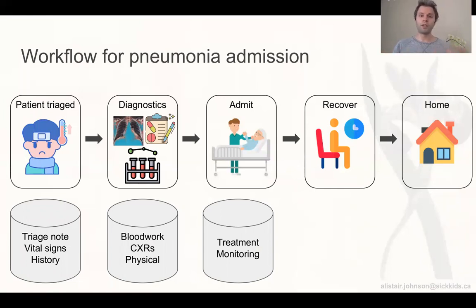And we'll hear more about combining multimodal clinical information with the chest x-ray later. And doing something like this is very important, for example, with a diagnosis like pneumonia, because pneumonia is actually a clinical diagnosis. You cannot make a diagnosis of pneumonia from a chest x-ray alone. Certainly the information from the chest x-ray is useful, but you also need systemic signs that the patient has some sort of illness. It cannot be done from the chest x-ray alone. So in some instances, you absolutely have to use all this information. Otherwise, you just don't have the full picture.